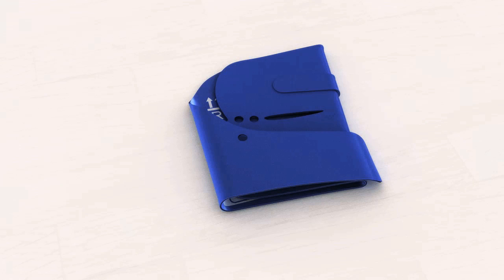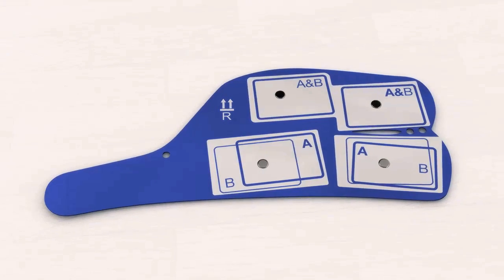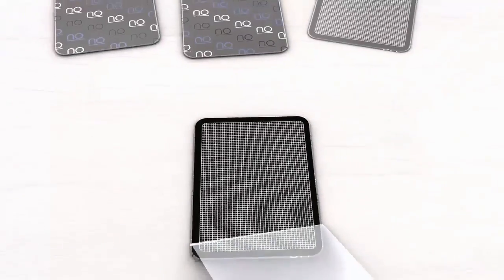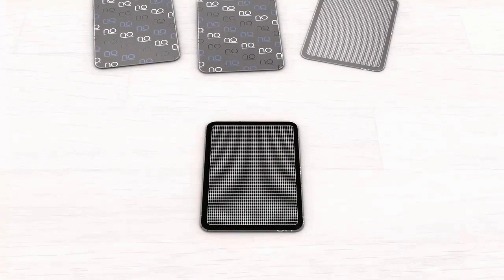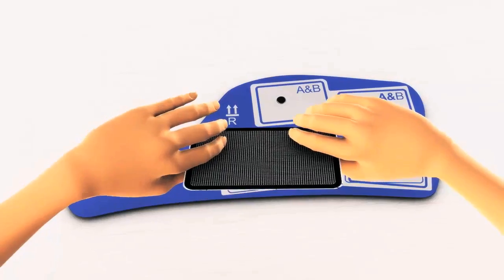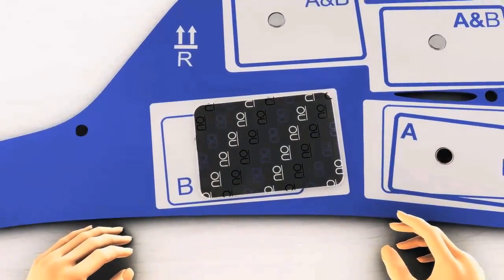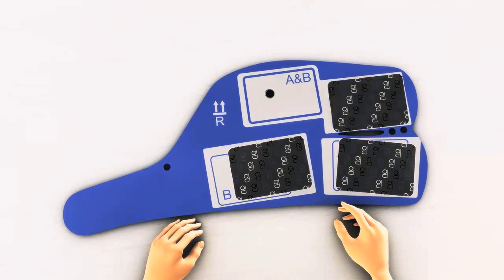Before you start your first treatment session you need to attach the self-adhesive electrodes to the thigh garments. Lay the right thigh garment flat on the table with the patterned side facing upwards. Take four electrodes and peel off the protective covers on the patterned side. Now apply the electrodes firmly on the thigh garment, placing them either inside the A or B position markings as indicated in your Neurotech Vital size guide.